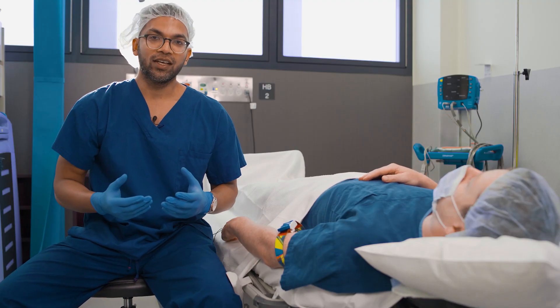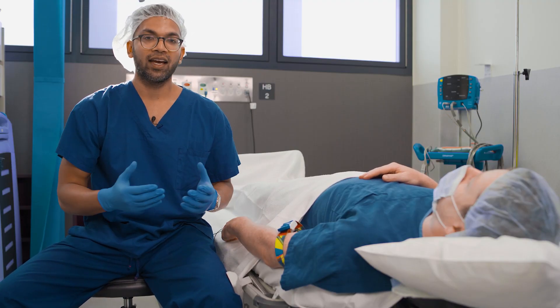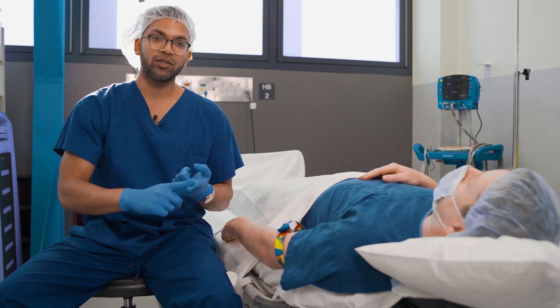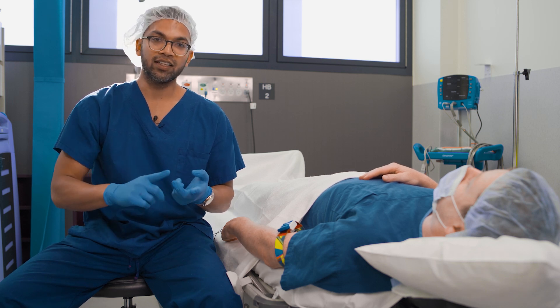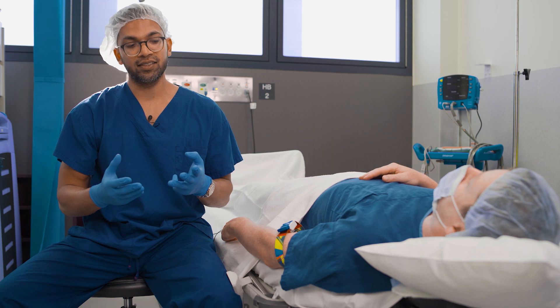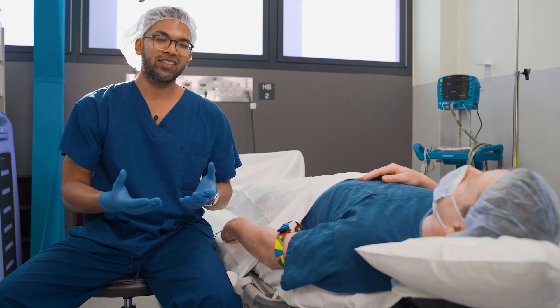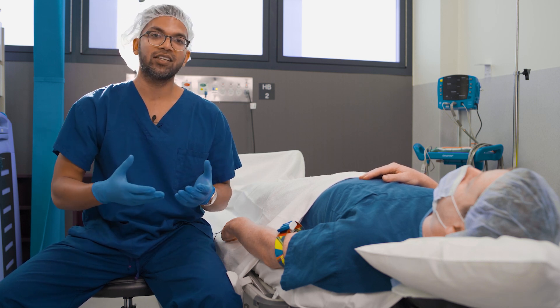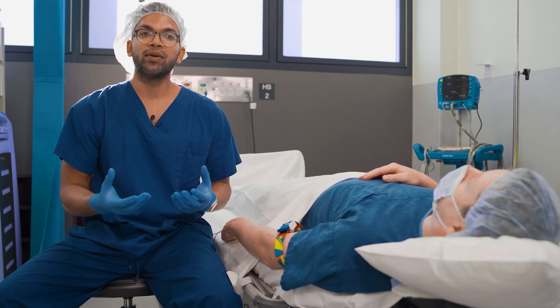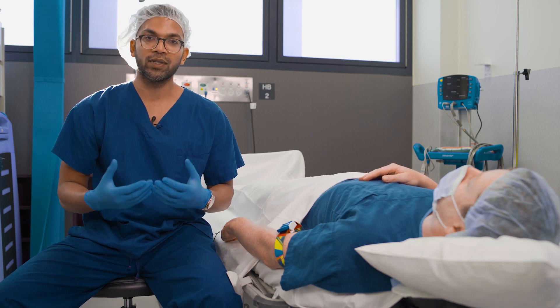The next thing to consider is whether to choose the left or the right hand. There are a few factors that influence this, including patient preference, the logistics of theatre, and surgical access. If they're a right-handed patient, I'll generally tend to put the cannula in the left hand so their dominant hand is free to use without too much hassle.